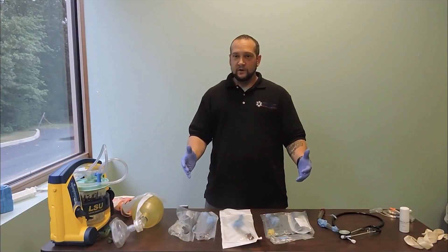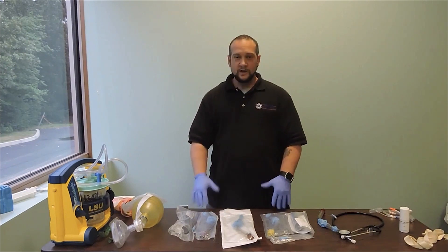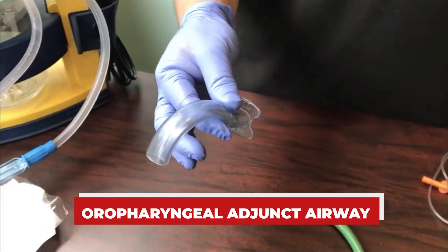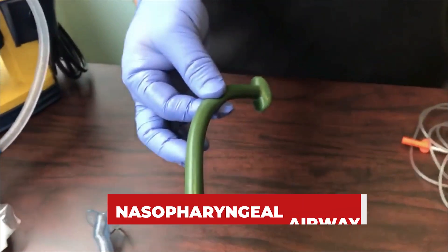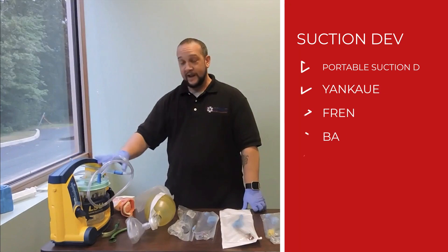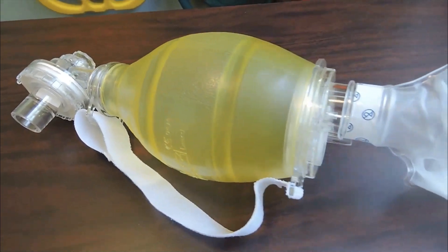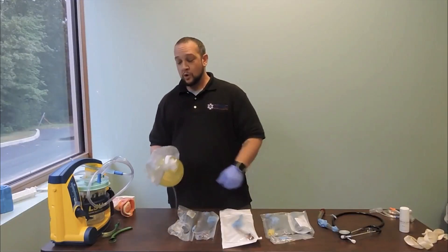Before we get started, we'll take a look at all the equipment we're going to need to complete the procedure. Anytime we're doing airway management, we want to make sure we have our simple adjuncts — our OPA (oropharyngeal airway) and our NPA (nasopharyngeal airway). We also need our portable suction device with our Yankauer tip and French tip suction, our BVM, a good mask, and our oxygen tubing connected to our portable oxygen tank.